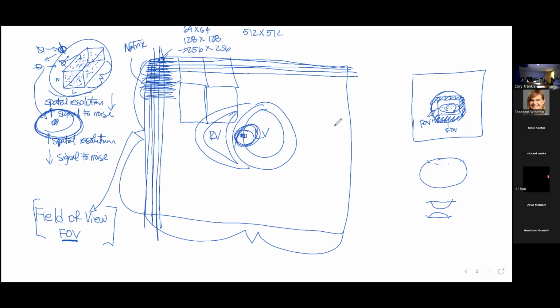You can have lots of signal, big voxels, low spatial resolution. My gosh, the thing is going to blow you out of the room. You can use it as a light on a steamship in the middle of the night. The whole screen will be so bright it'll light up the room. Okay? But you're not going to be able to see what's in there, because there are tons of protons, but you haven't got the spatial resolution you need, the definition to make out different structures. Okay? And so that's very important.